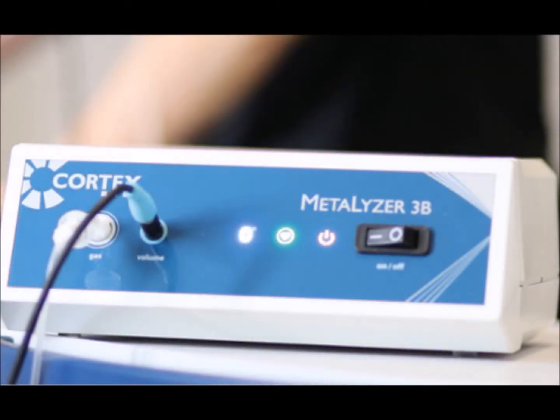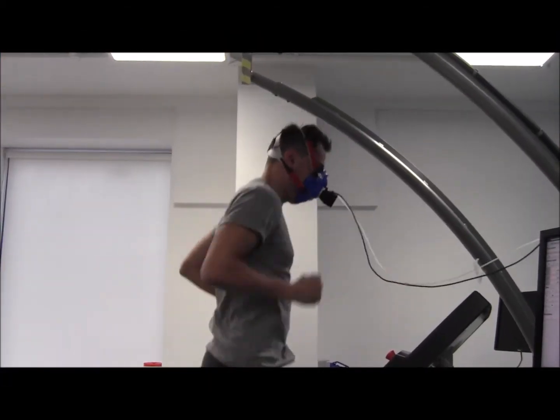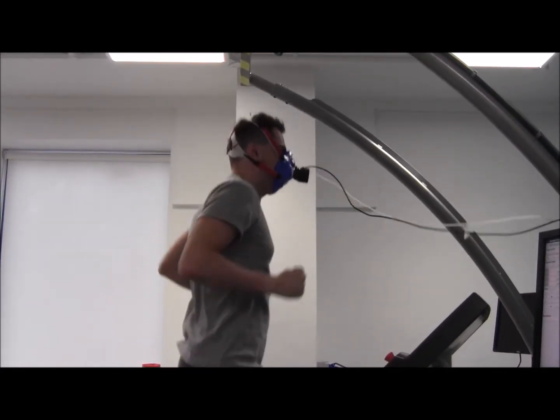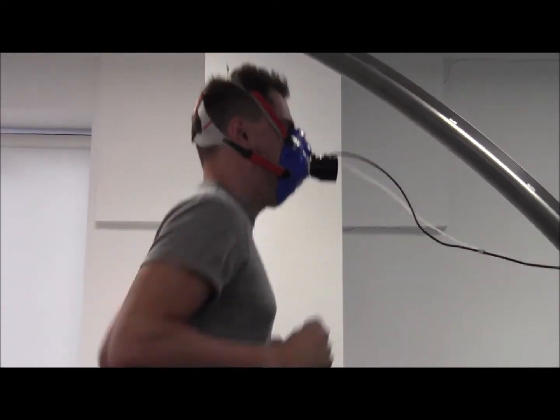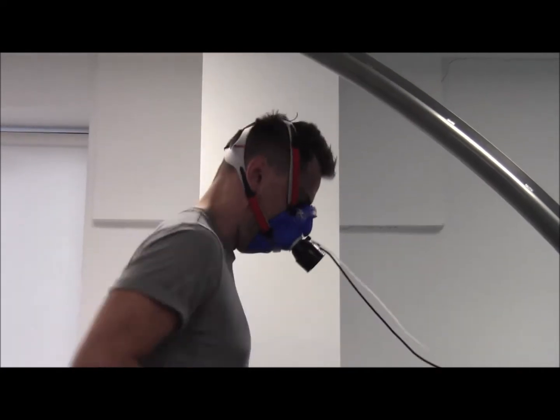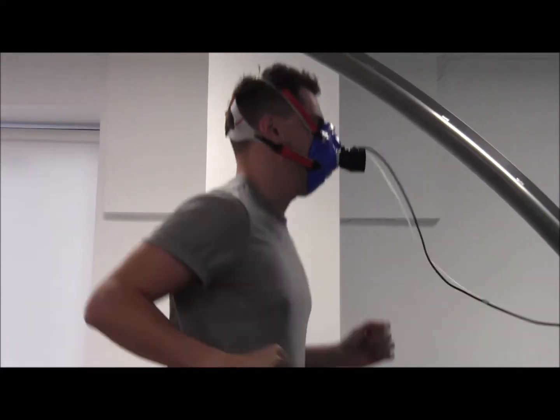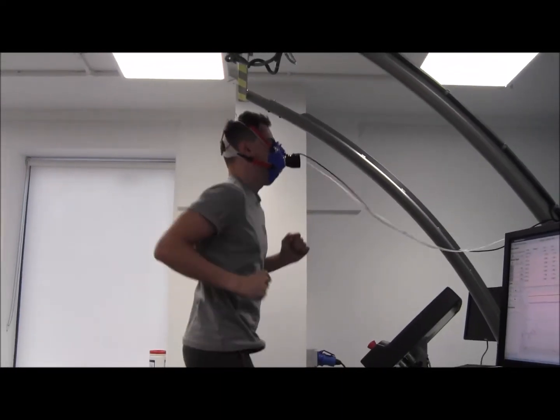The Cortex Metalyzer-3B is a metabolic stress test system that measures respiration and gas metabolism during treadmill or cycle ergometer exercise with a breath-by-breath technology. Direct measurements of circulation, gas exchange, and ventilation can be obtained from this metabolic cart. The Metalyzer-3B is a useful tool within clinical settings, particularly for the diagnosis of cardiorespiratory diseases.